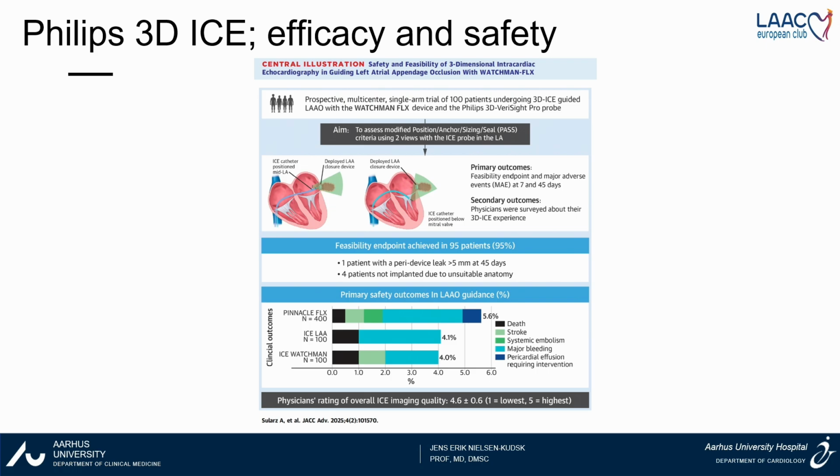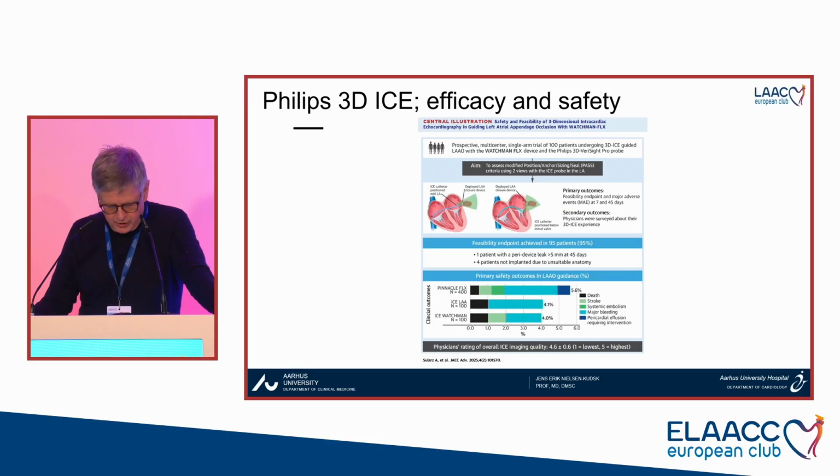So this 3D ICE catheter from Philips has been available in the US for a while, and this is the first study from the Mayo Clinic, which was one of the first sites to implement this new catheter, and they have demonstrated in this cohort of 100 patients that it's feasible to use ICE.